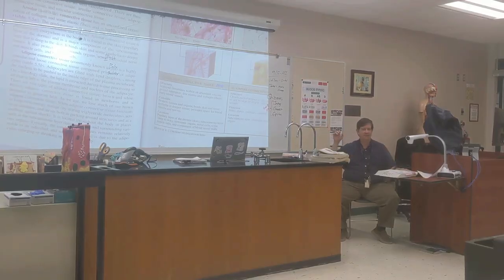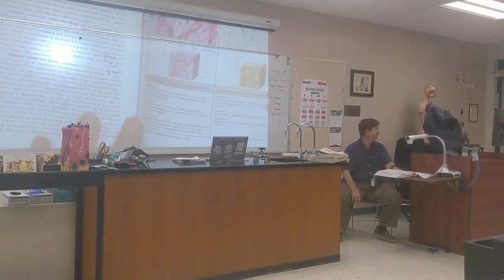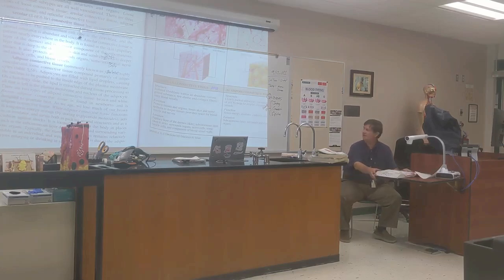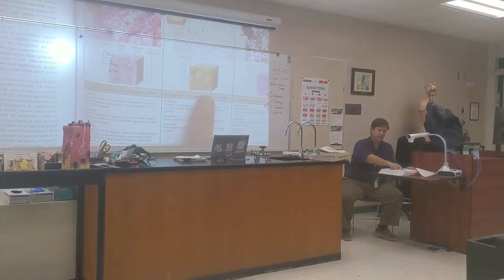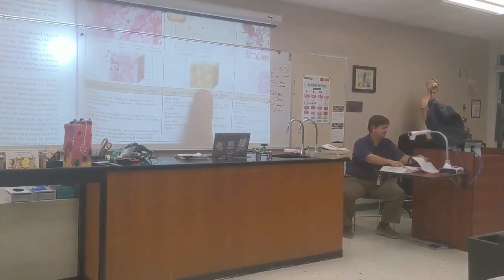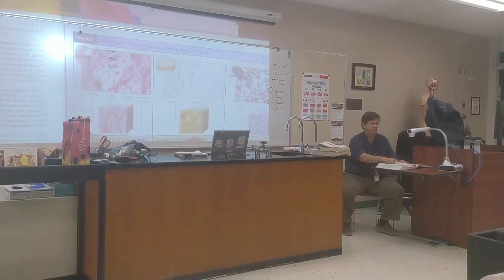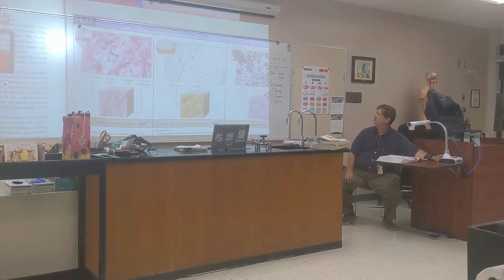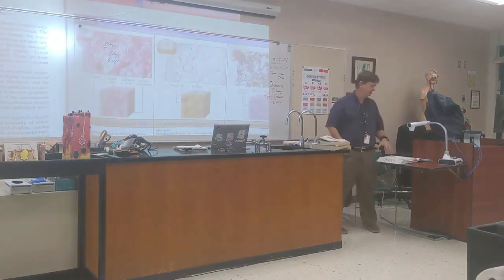Does that make sense? All right, so we've got the first of the ones on there, areolar connective tissue. The next one is the adipose tissue, and that's the next picture. This is a perfect picture because it's a drawing. This is a photograph, so it's more accurate, but it's hard to understand what you're looking at. Let me make this a little darker so it's a little easier.